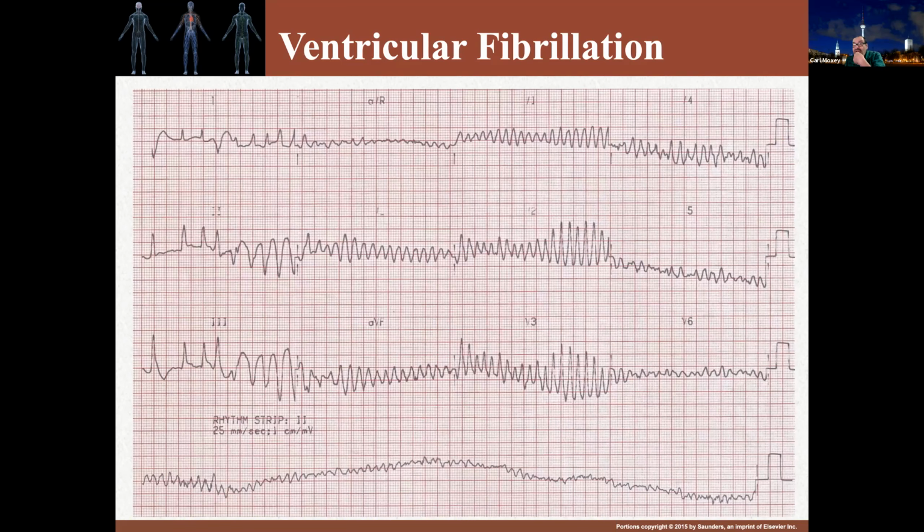And this is a tracing of ventricular fibrillation. Actually, this began over here. These 3 beats here are actually a ventricular tachycardia. We're kind of tachycardic even between these 2 beats, because you'll notice we're 300, 150, we're about a ventricular rate of about 120. But then that shortens, in these last beats here, to 300, and now we go into the fibrillation.